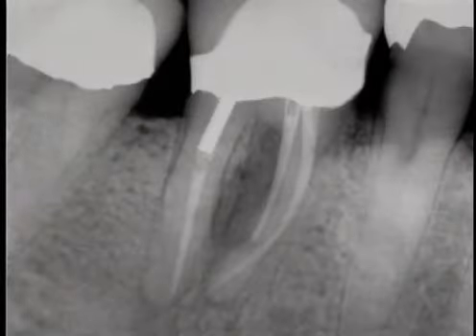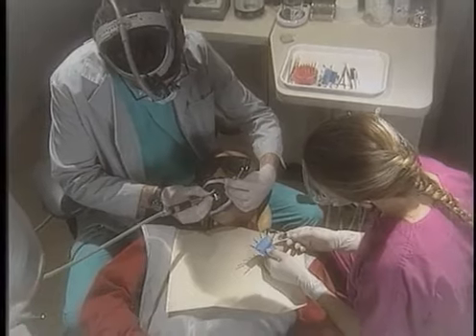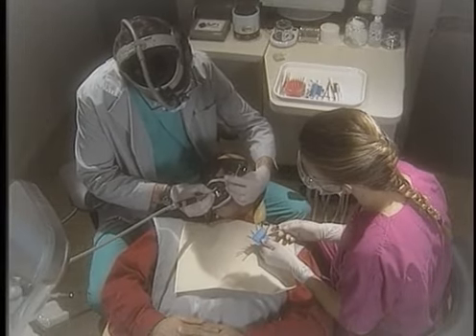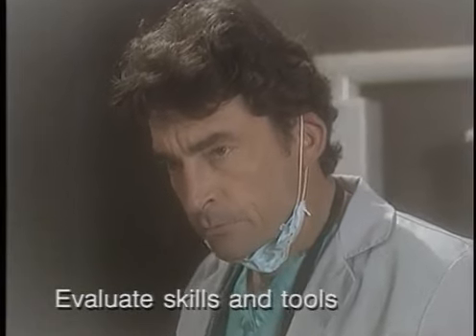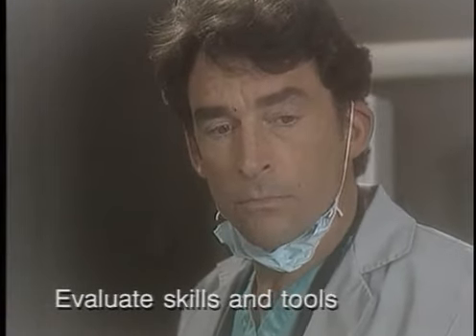Sixth, training, experience, and technology. In evaluating teeth for endodontic retreatment, it is essential to appreciate there's never just one problem to overcome, but a series of challenges that must be addressed to produce successful outcomes. Clinicians must honestly evaluate, do I have the training, experience, and technology to disassemble this tooth and then prepare it for 3-dimensional cleaning, shaping, and obturation?